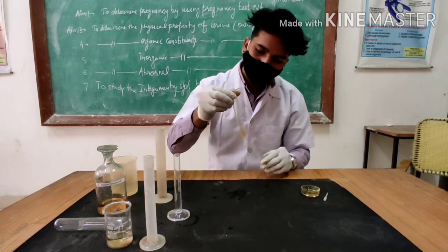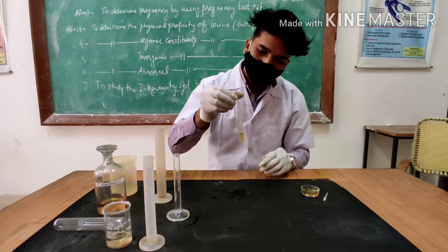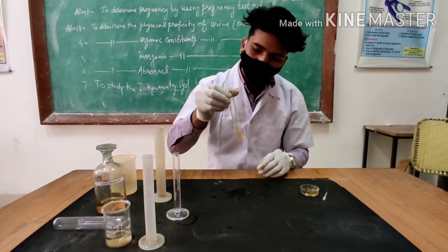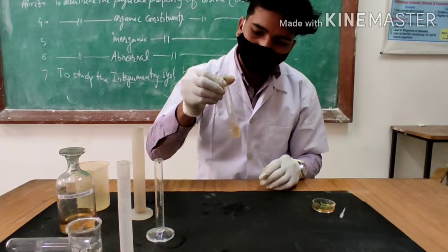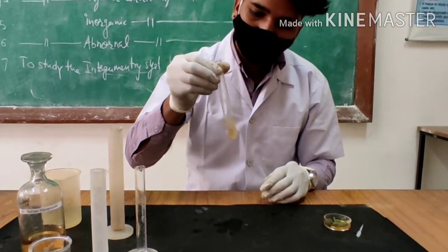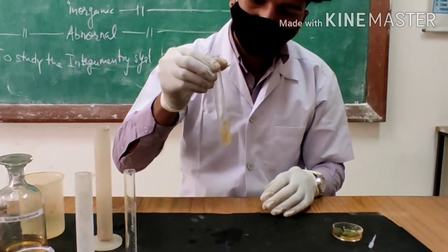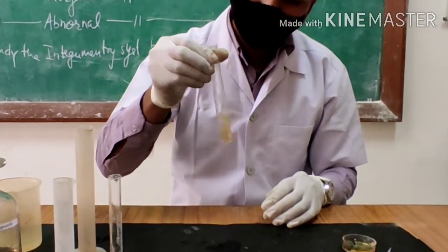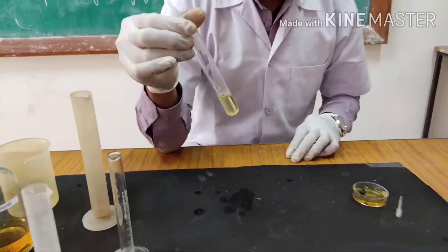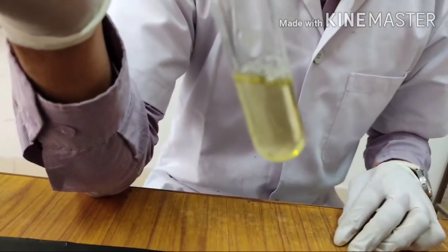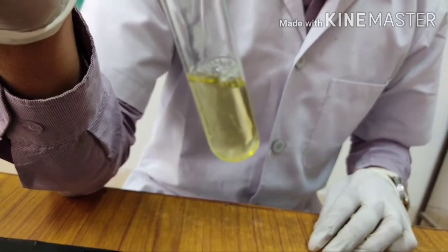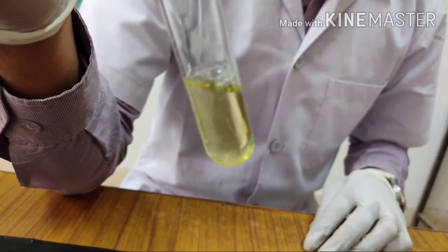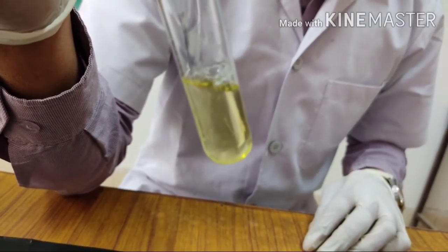After adding all 3 constituents, reddish-yellow colour or ruby red colour should be observed, which will confirm the presence of creatinine. A yellow colour was observed, which confirms the presence of creatinine in the given urine sample.